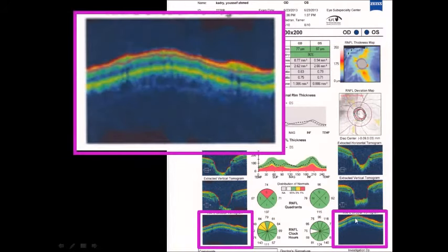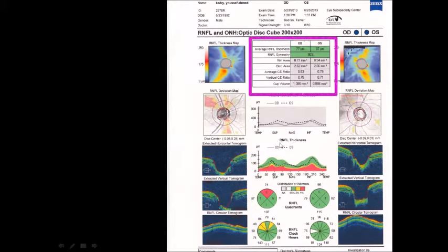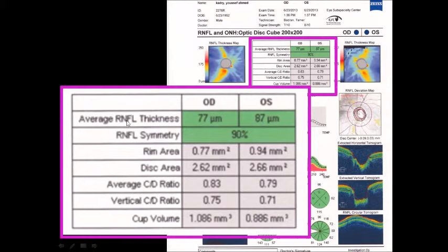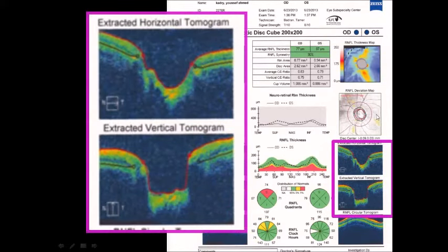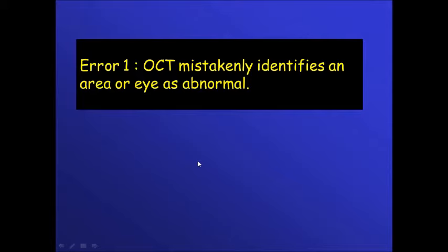We need to check that the segmentation is correct — that the machine correctly identified the retinal nerve fiber layer. We can see the different parameters of the retinal nerve fiber layer and the disc. There is also a vertical and horizontal cross-section of the nerve, which is important to verify that the machine correctly identified the end of the retinal pigment epithelium and Bruch's membrane.